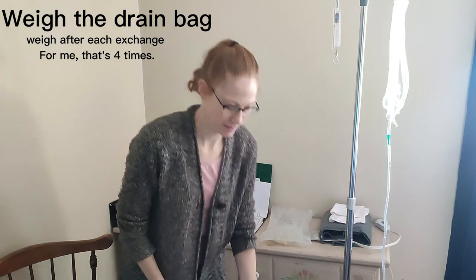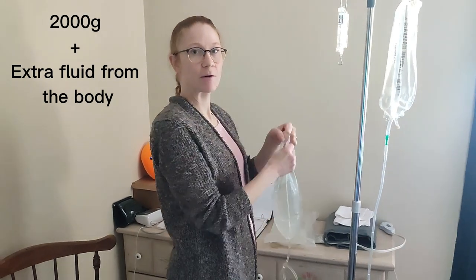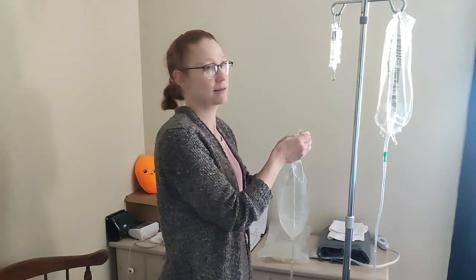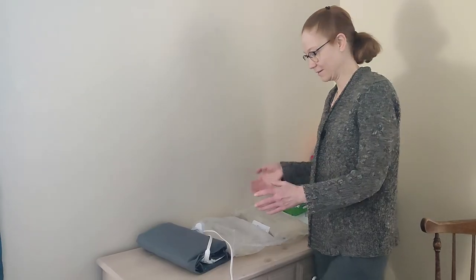After I'm done with that, I'm going to weigh the drain bag so I know how much fluid was pulled off my body. The amount of fluid I put into my body weighs about 2,000 grams, so when I weigh the drain bag, whatever is over 2,000 grams will be how much fluid was pulled from my body — just like your kidneys pull fluid so you're able to use the restroom; this is kind of what this does. Make sure that you write it down.